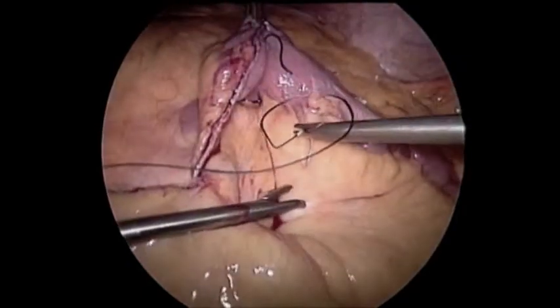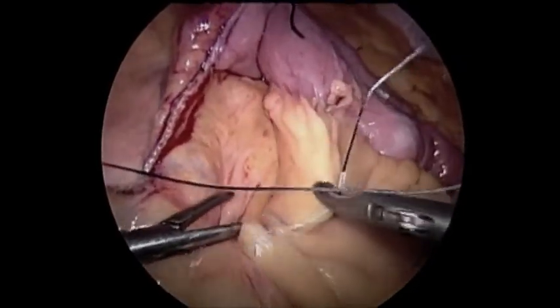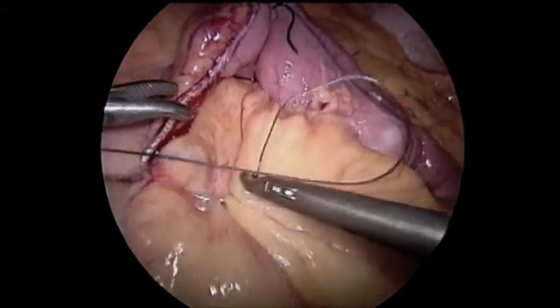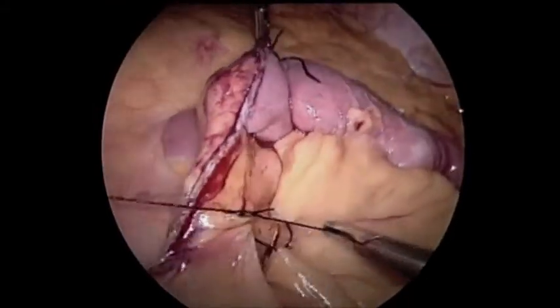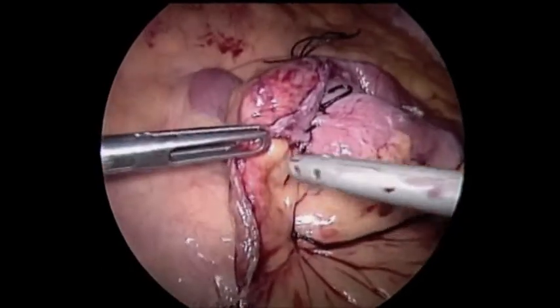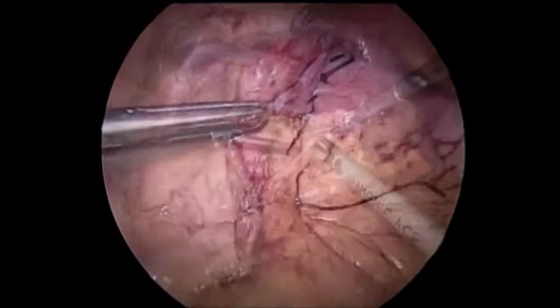We feel very strongly that it's important to close all internal hernia defects, so here we're using 2-0 silk to close the distal mesenteric hernia defect. One hint: using a needle that's a little bit larger than a standard GI needle makes it much easier to do a purse-string closure and speeds up your mesenteric closure. There's our completed distal mesenteric closure.